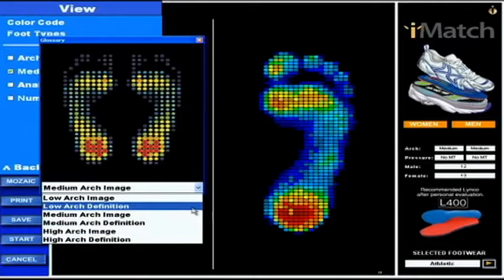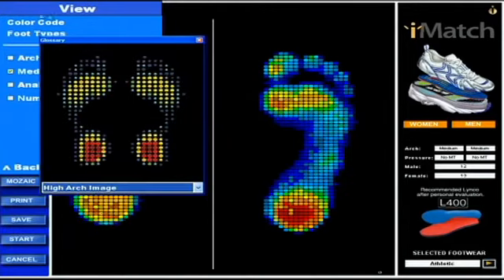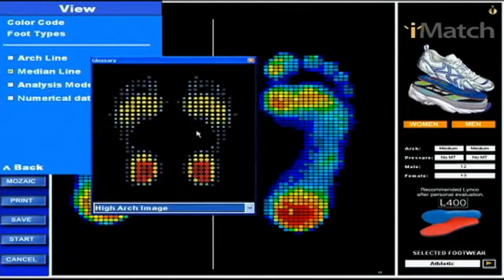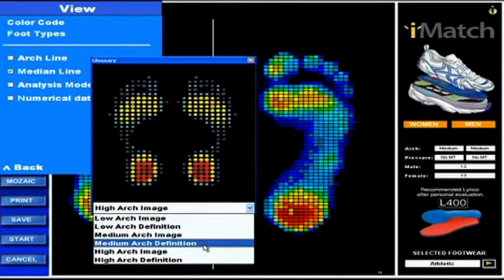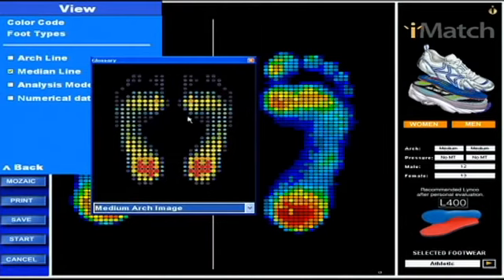Now, which one of the three does my foot look most like — low, medium, or high? It's actually medium. I'm close — we're kind of in between. Here's the high arch, and you can see in the high arch foot it's typically not as filled in over here. Medium arch is a little closer to what mine is.